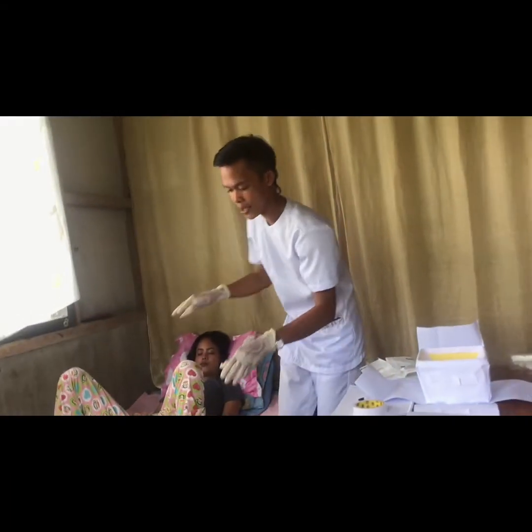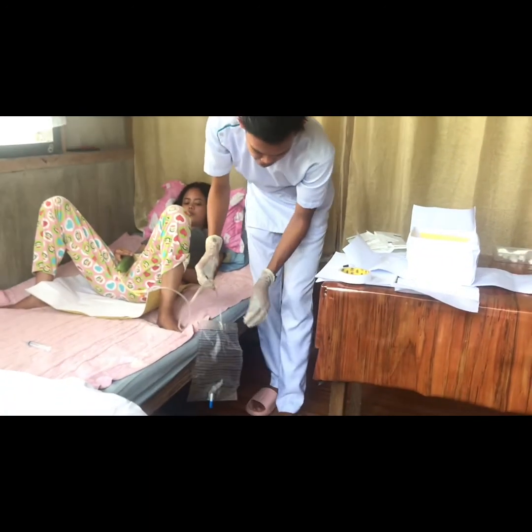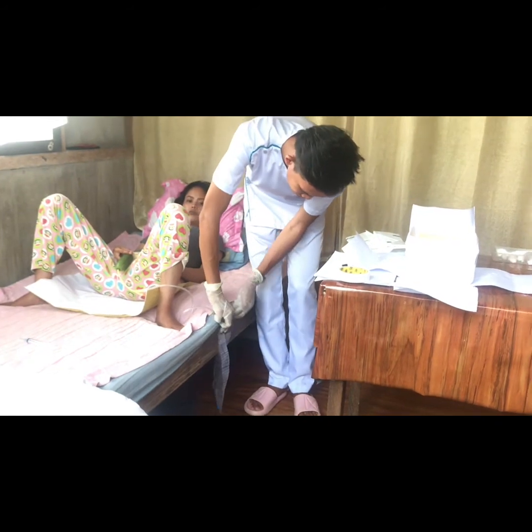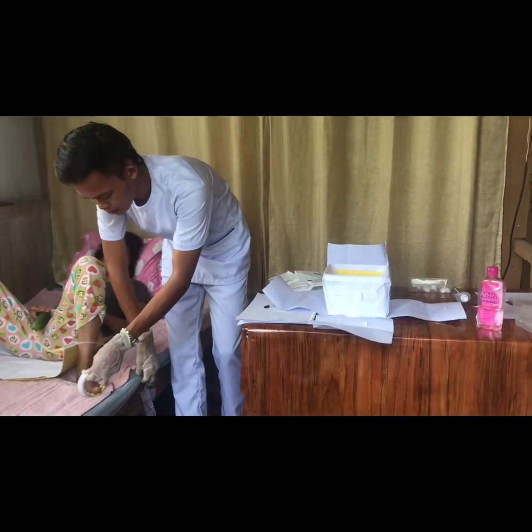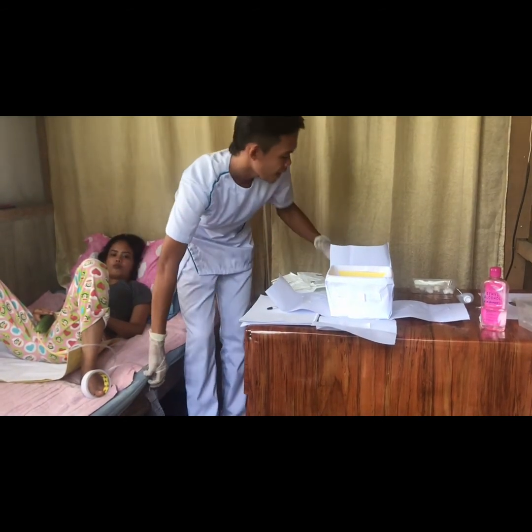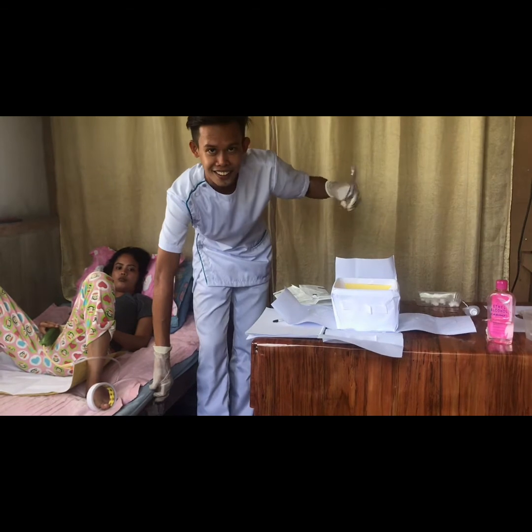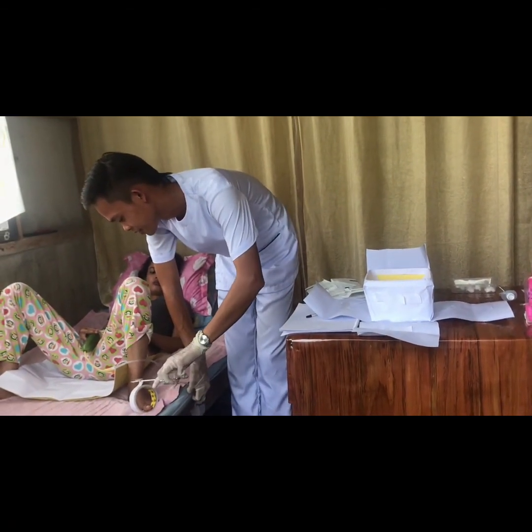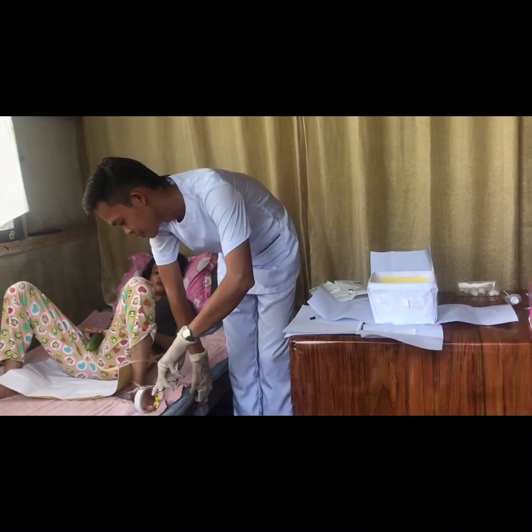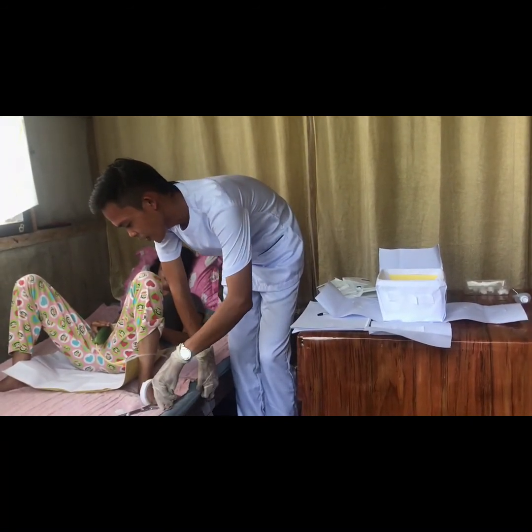Okay, so in the meantime, I'm going to place this urine bag. And we have the forceps, okay? This is a forceps. Are you okay, sir?